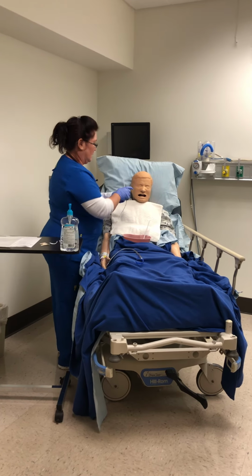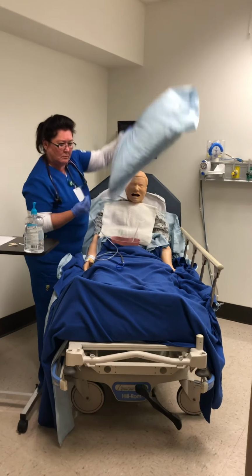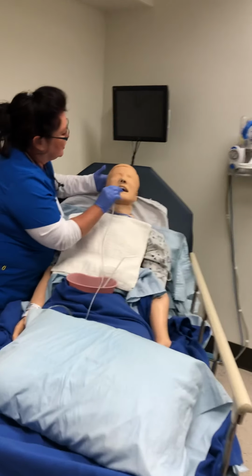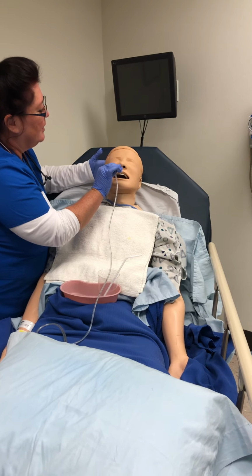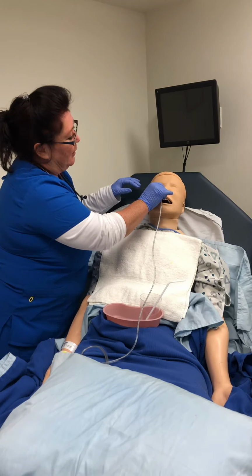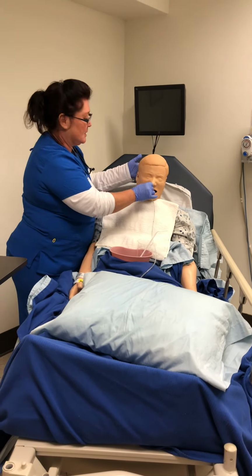Okay, so Shirley, I'm gonna take the pillow out from behind her head and have her hyperextend her neck. Okay, Shirley, on the count of 3, I'm going to start inserting. 1, 2, 3. And I'm going to go just to the back of the throat when she gags. And I'm going to pull it out 1/8 of an inch. And then I'm going to have Shirley bend her head forward, closing the epiglottis.